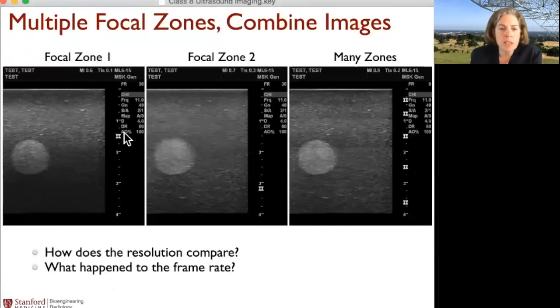Again, the idea is that you're going to use a subaperture and you're going to put the phases such that you're going to focus at a particular point in the image. If you want to focus to a different point in the image, then you might use a different set of phases so that now the beam is smallest at that second focal point. And you can get multiple images at different focal depths and combine them all together.